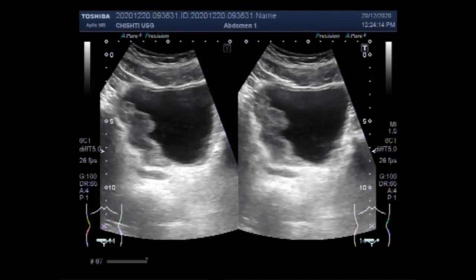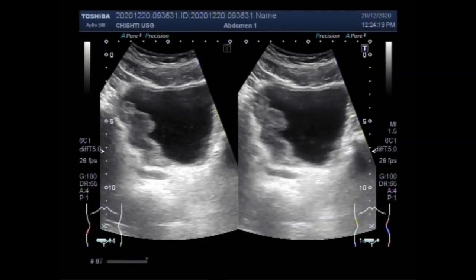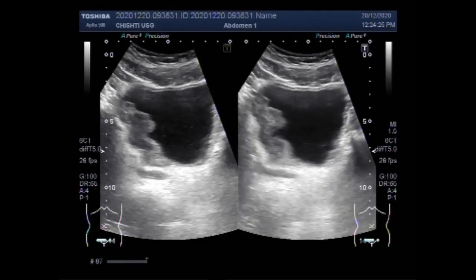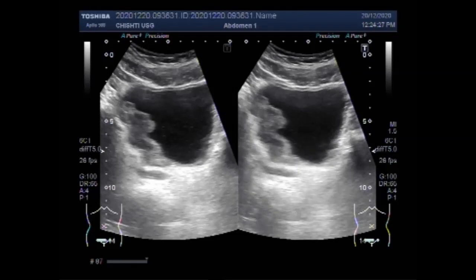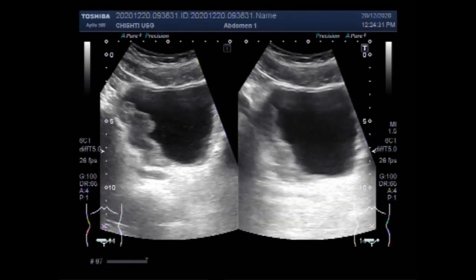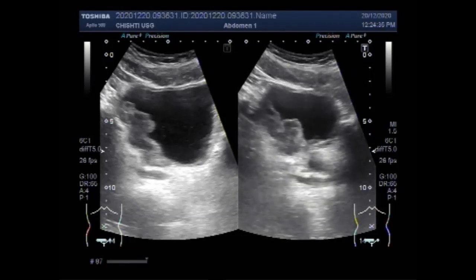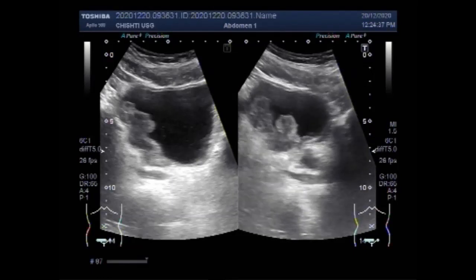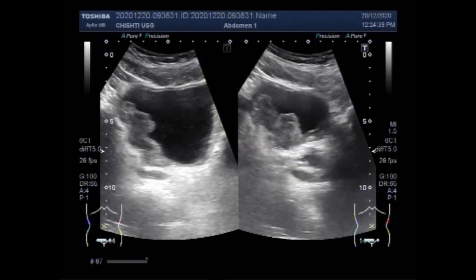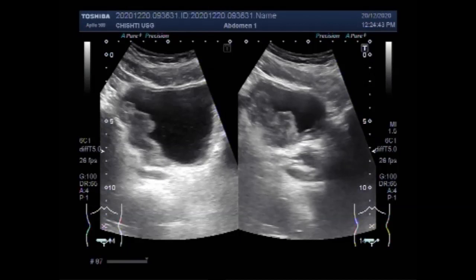Sonography enables detection of 95% of exophytic lesions within the urinary bladder with the diameter exceeding 5 mm. Mostly it is carcinoma of the urinary bladder due to its malignant character and the need for aggressive surgical treatment. A correct diagnosis of this disease is essential for the patients, as the lack of adequate treatment and delayed treatment considerably affects the prognosis of this disease.